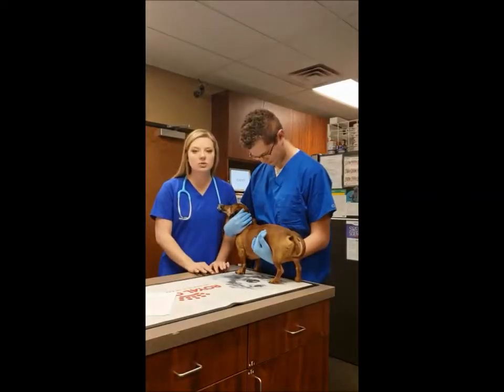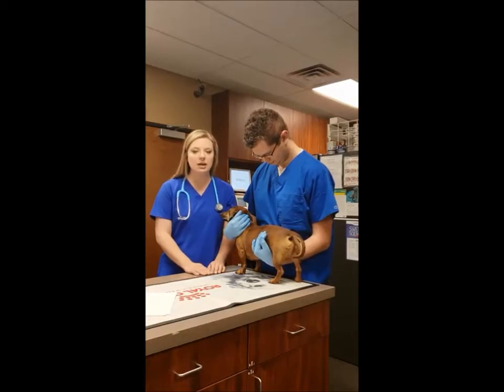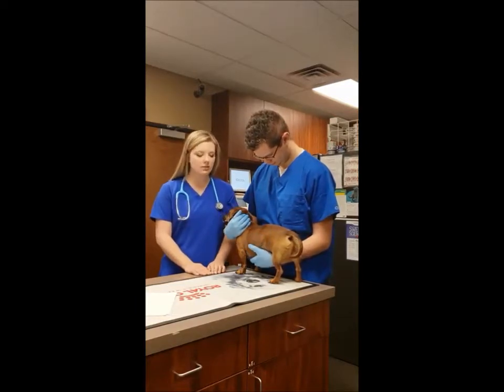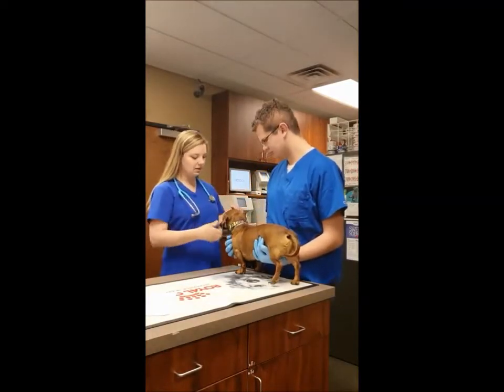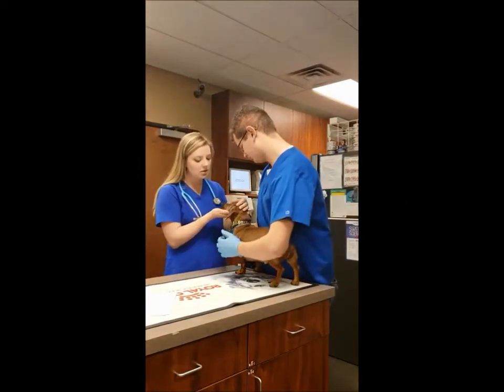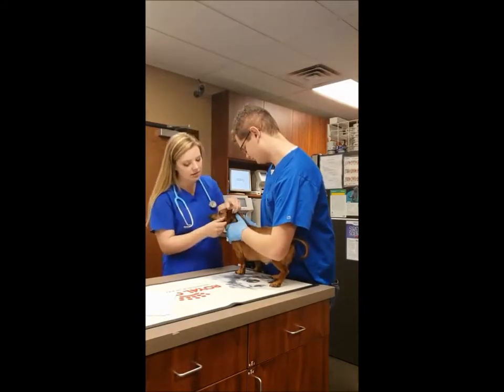Okay, I'm going to demonstrate a physical exam on a dog, and I'm going to also show how to obtain a TPR and auscult the heart and lungs. I will also give our patient an ASA grade. So, start with our physical exam. Start with the eyes to the ears.